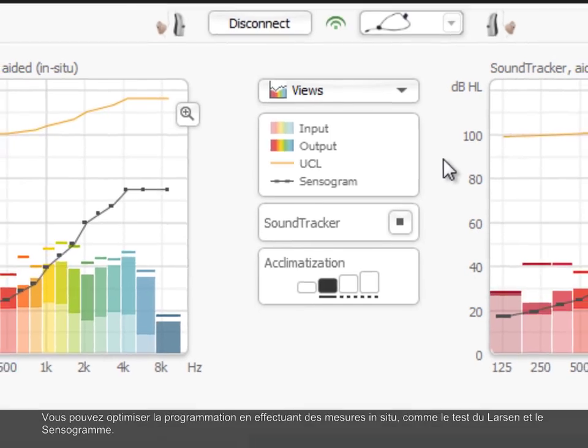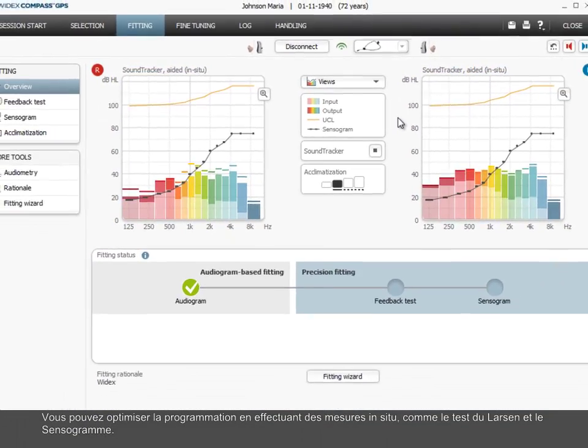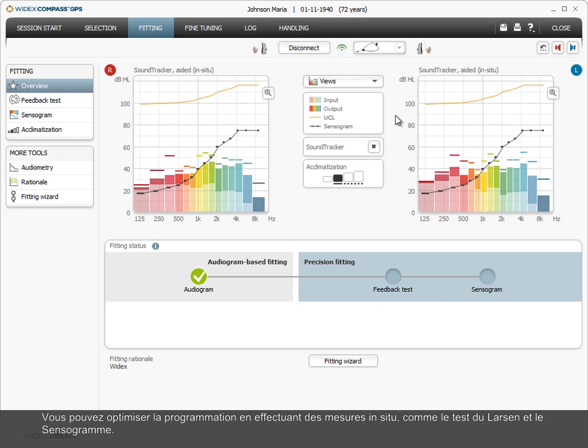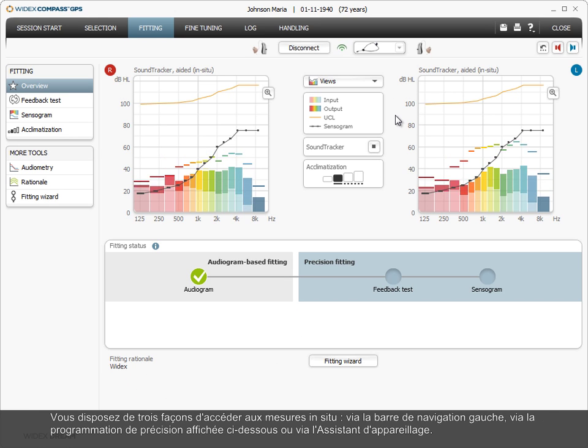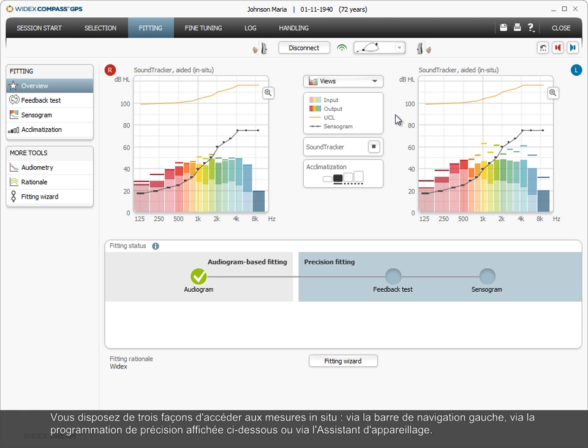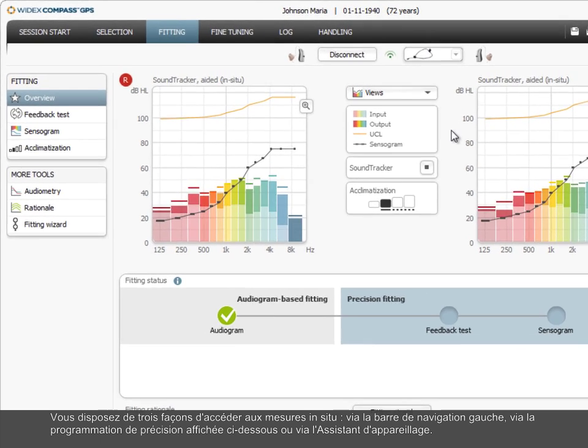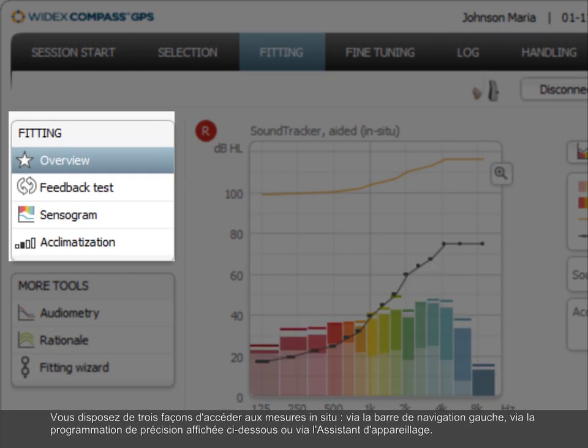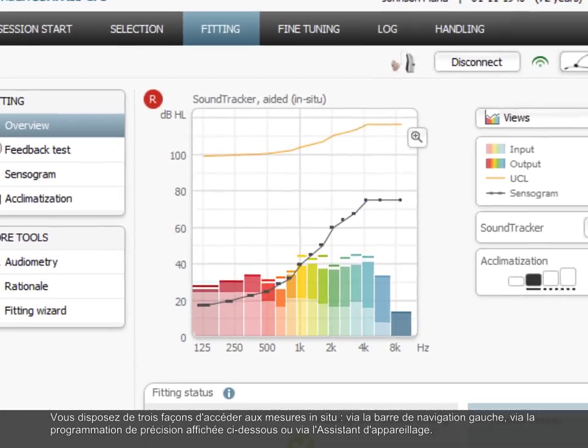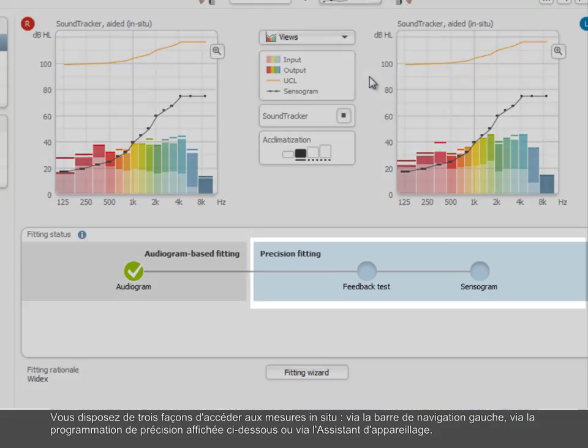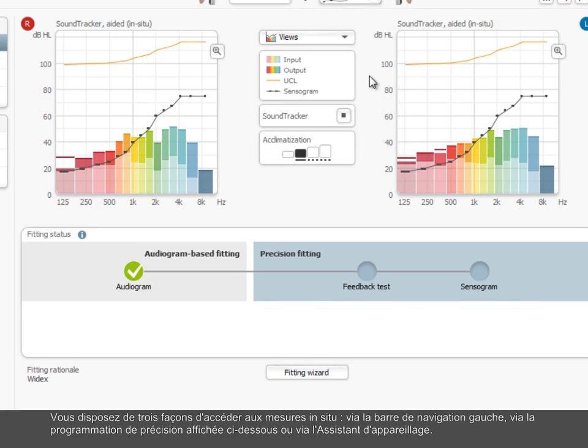You can optimize the fitting by making in-situ measurements, such as performing the feedback test and the sensorgram. You have three ways of proceeding to the in-situ measurements. You can access the measurements via the left navigation bar, via the precision fitting shown below, or via the fitting wizard.